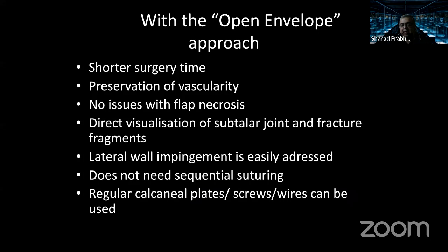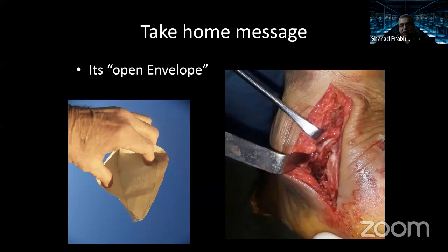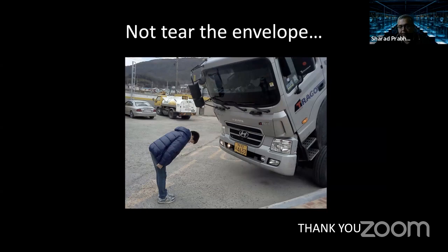You can use a regular plate or a screw or a wire or what have you, depending on the sources you have. So it's just respect the soft tissues. You can lift your envelope up and not tear the envelope. Thank you.